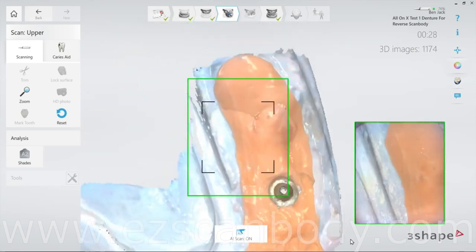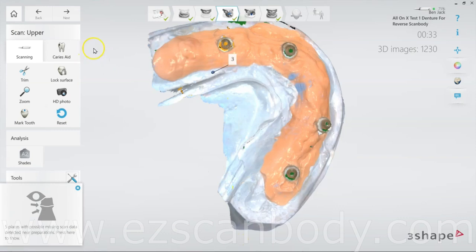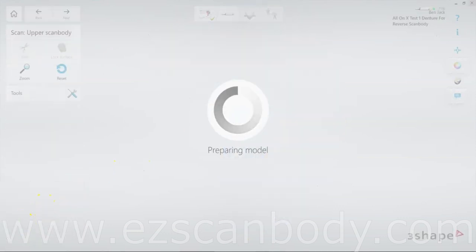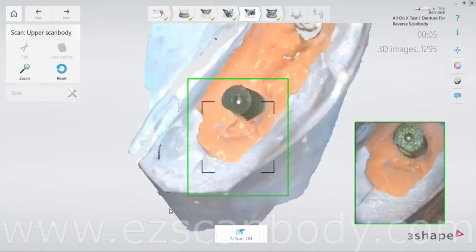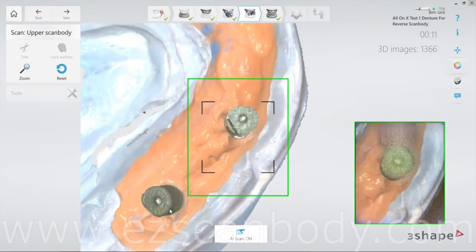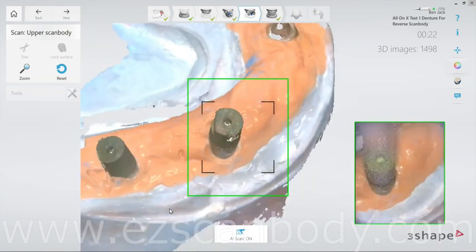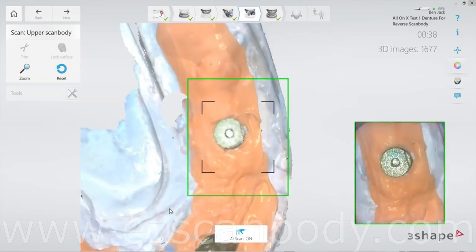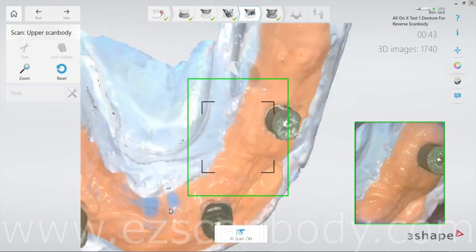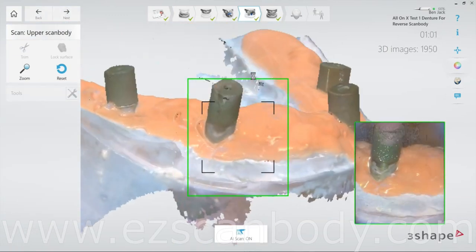Now the scanner prompts you to click on the prepped tooth. While the scanner assumes it's scanning a prepped tooth, we're actually scanning the full jaw, so the exact location of the tooth doesn't matter. Place the H-Cap scan bodies over the multi-unit abutments — these scan bodies are sandblasted, making them easy to scan. Ensure they are securely screwed tight for accurate data capture. The process won't take much time since the jaw was scanned earlier and we're only adding the scan bodies now.